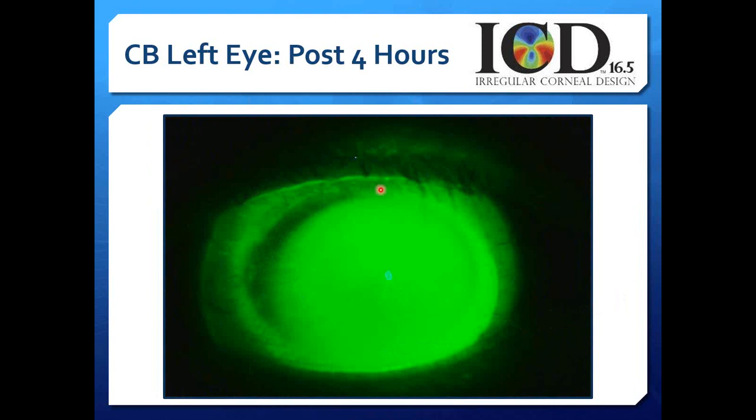Do you need to change this vault? And if you look out here on the conj, it looks like we can see fluorescein molecules here. So is this bearing, or is it thinning of the fluid? And that's where it can get a little gray. So if you're not sure or you're not comfortable, then just call up the lab and order a limbal clearance zone +5. Increase that vault through that area.